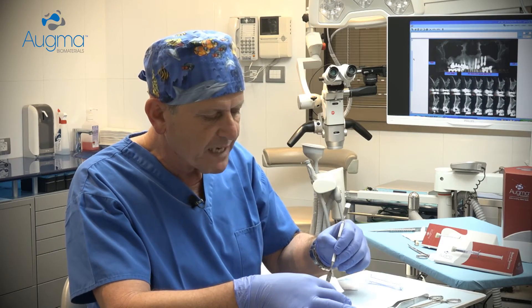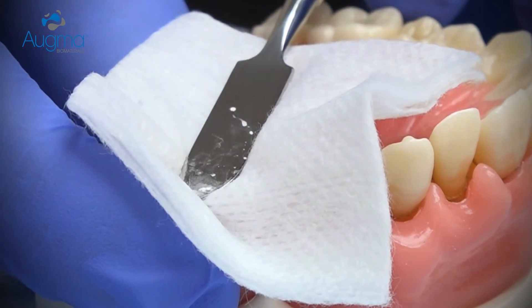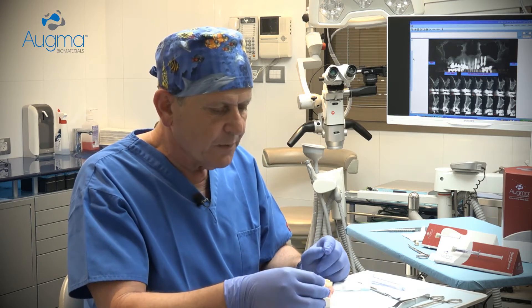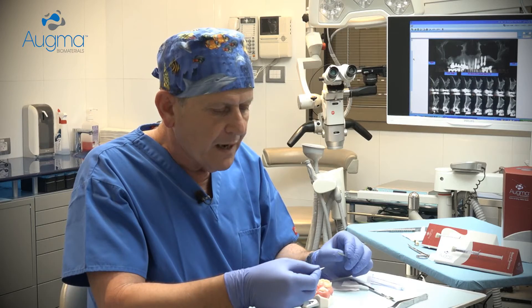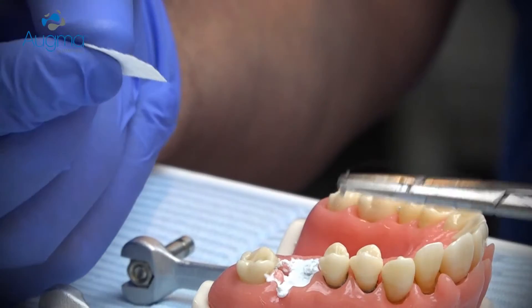If there is not enough space for your finger between the teeth, use a spatula or an elevator and press above the dry gauze. Now you cannot leave the material exposed. What you need to do is take a barrier — which can be a simple collagen sponge — and place it above the graft. However, it must be sutured together with the soft tissue.